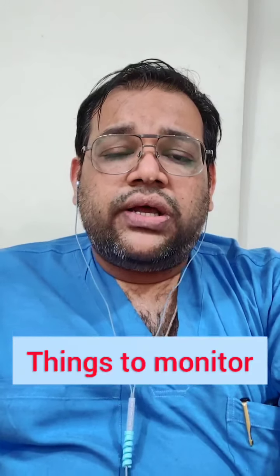Now once you put the patient on pressure support, you are happy with the pressure support and the tidal volume and everything, what things do you have to monitor? So you have to monitor whether the patient is comfortable and, cardiorespiratory wise, whether the patient is tolerating the reduction in ventilator support. So you have to monitor heart rate, blood pressure, oxygen level. You have to see clinically if the patient is struggling, if there is sweating. Sometimes if the patient is interacting, the patient may suggest by gestures that he or she is not feeling comfortable. Also you have to see the minute ventilation. So if the patient is becoming tachypneic or developing hypopnea, both things can happen, and what is the tidal volume that the patient is generating consistently.